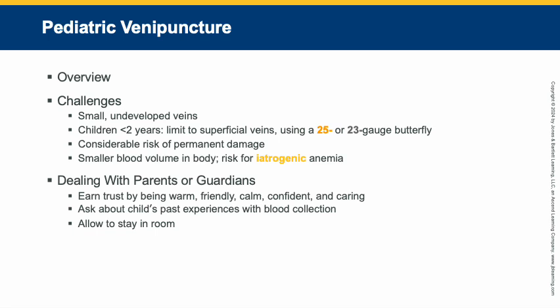Okay, capillary collection is normally recommended for pediatric patients because you don't want to draw a lot of blood out of them, especially newborns and infants up to 12 months. Their veins are small, not well developed. You may even permanently damage them. However, sometimes capillary is not feasible or possible due to the volume of tests they've ordered. If venipuncture is necessary on pediatric patients, you still have to have some skill and you're going to need some help in holding them.